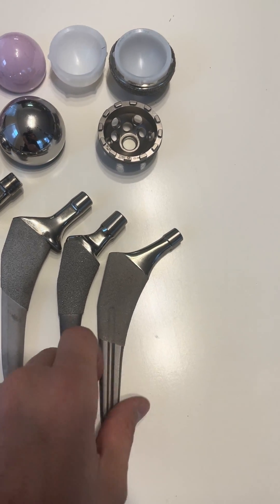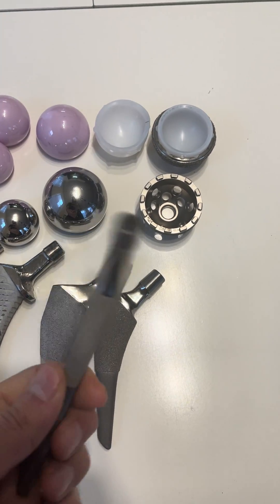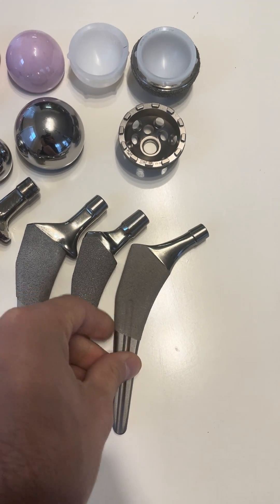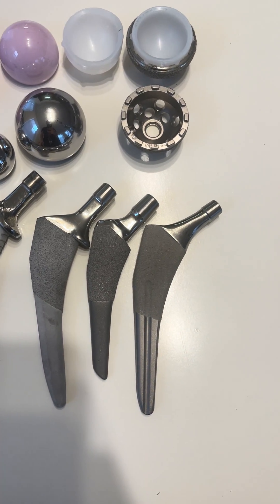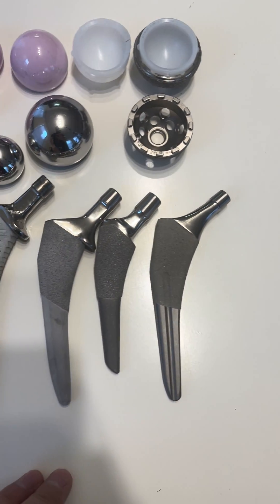This is a very basic stem called a blade stem. You can see the design is such that it kind of looks like a blade. It gets its fixation in the metaphysis of the bone with this surface to ingrow. It's been used for a while and works well.